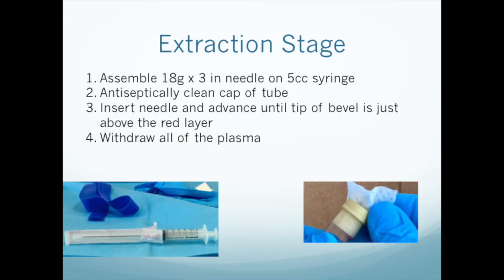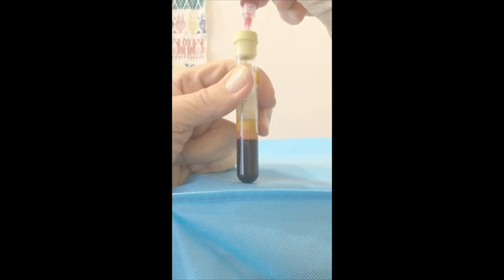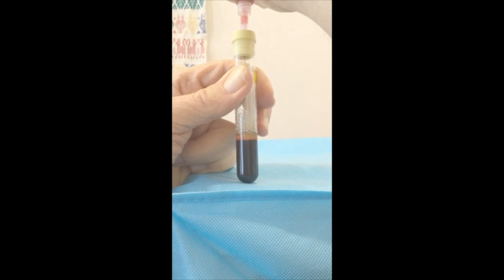Put a 3-inch needle onto a 5 cc syringe. Gently remove a tube from the centrifuge and, keeping it upright, move it to a firm, well-lighted surface. Antiseptically clean the cap and insert the needle through it until the tip of the bevel just touches the top of the red layer. Gently, without disturbing the red layer, aspirate the plasma, then withdraw the needle.